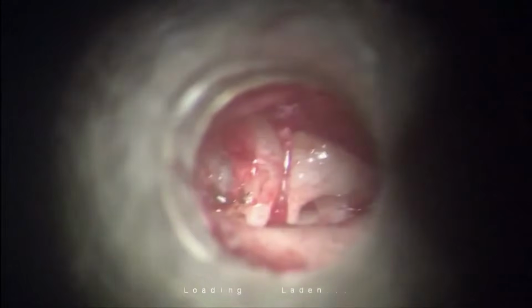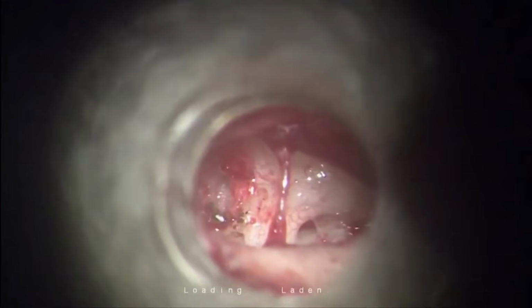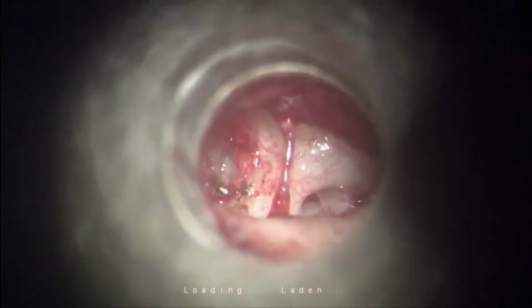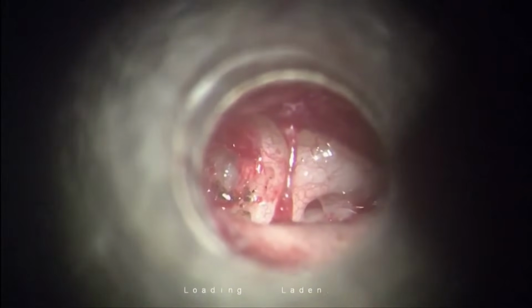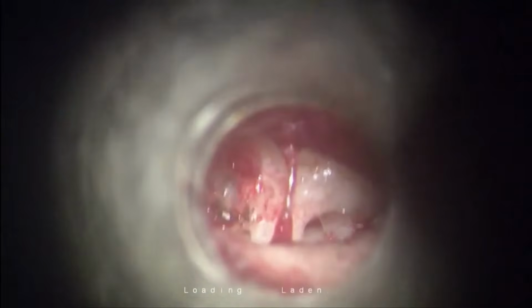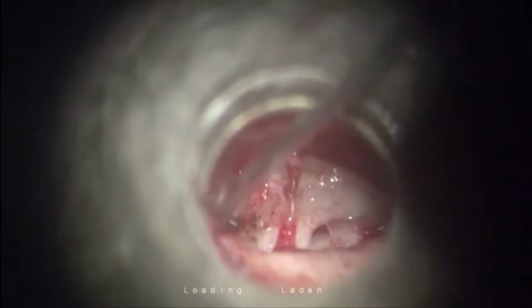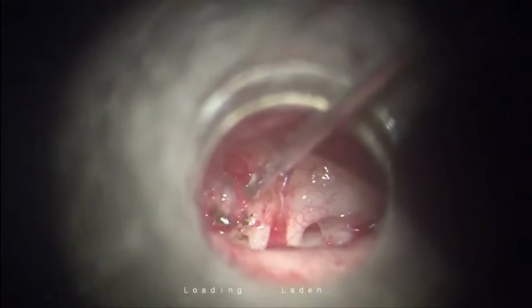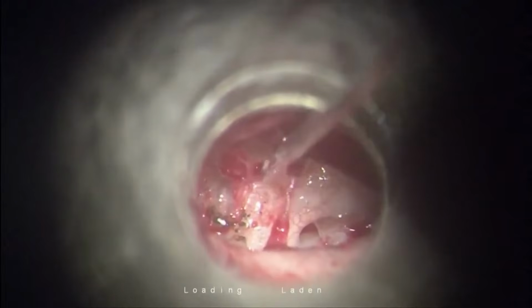Sir, I have a question. Ashish sir mentioned that the piston has to be perpendicular. So there is no particular site for stapedotomy? We need to have a perpendicular piston irrespective of the site of the stapedotomy. Is it true? No, but generally you have to make sure that it is in the posterior part, because as Satish earlier mentioned, the problem here is that you want to stay as far from the utricle and saccule as you possibly can. Yes. Okay.